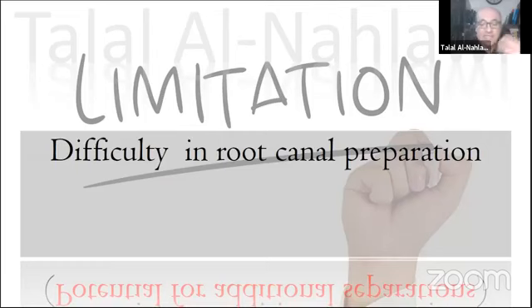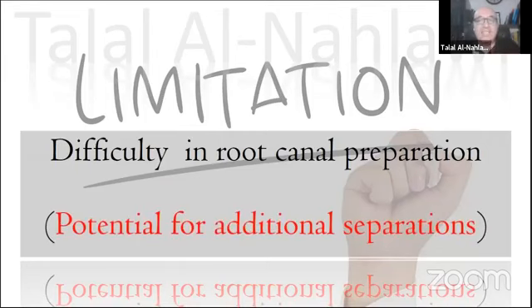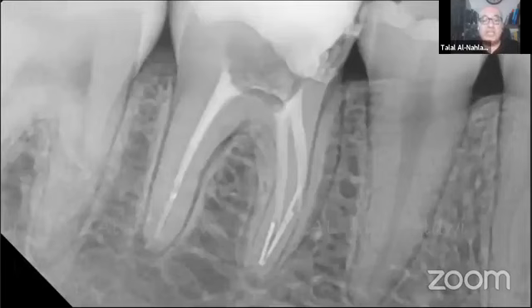So this sometimes may lead, I'm not saying 100%, with a skilled dentist like Hamo, like Alberto, like so many of the dentists that are listening to us, I'm sure that they will do sufficient flaring. But I'm afraid that sometimes, if an expert tries to deal with removal in an expert way, he will remove too much structure, and also in bypassing, I'm afraid that we have a potential for this scenario. Let's see this case.